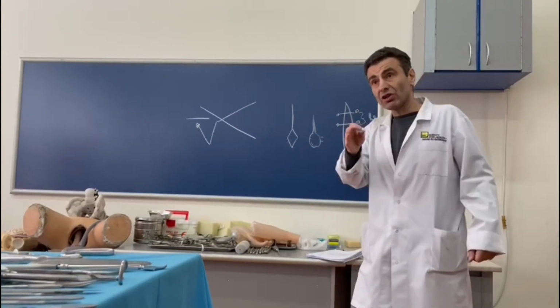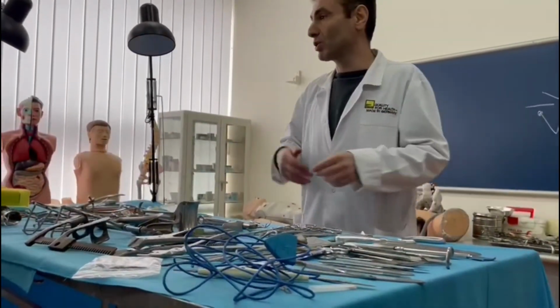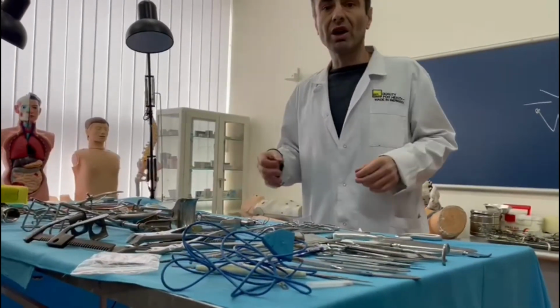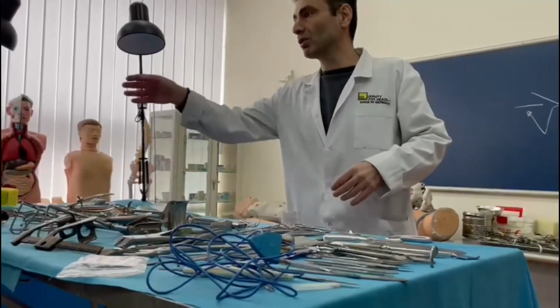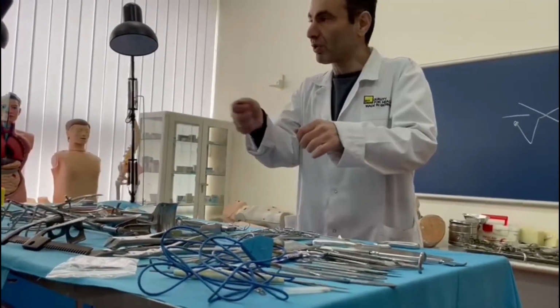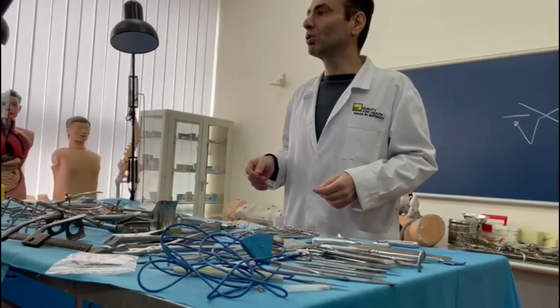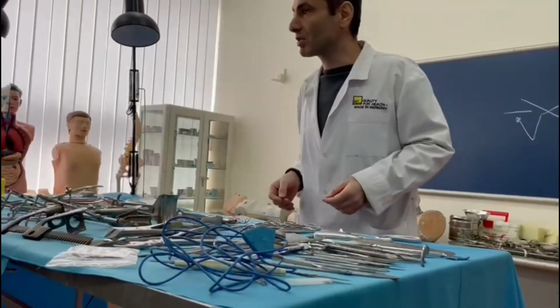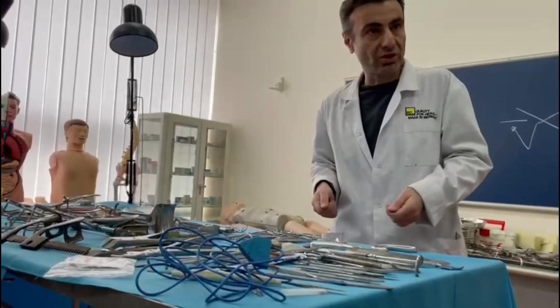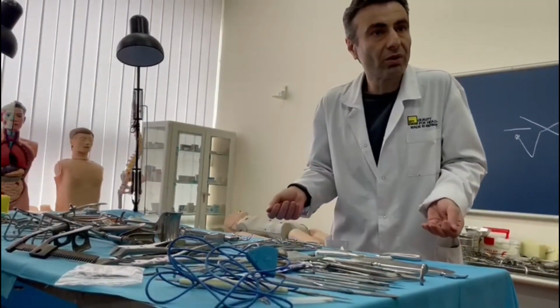For each tissue, for example, during the second stage, which kind of connections can I do? For example, I need to apply an anastomosis between 2 different organs, for example, stomach and intestine. Of course, for that purpose, I want to suture the tissues. Or, for example, I need to apply a stoma in the stomach wall. Of course, I must suture the stomach with the tissues of the anterior abdominal wall. Let's say this is normal.